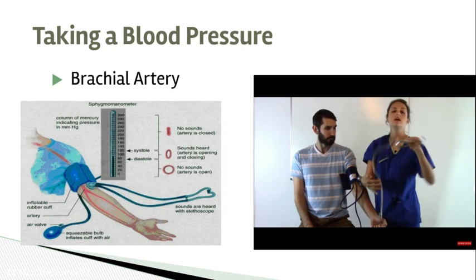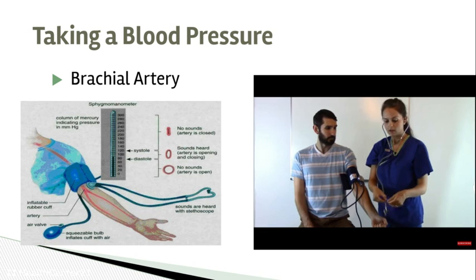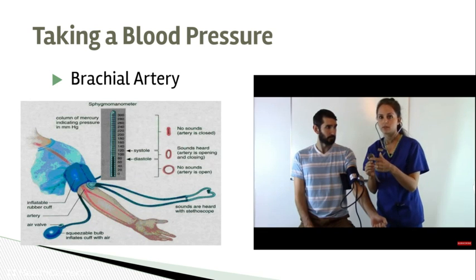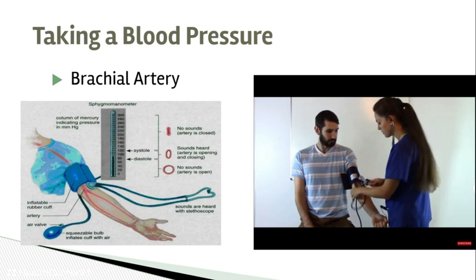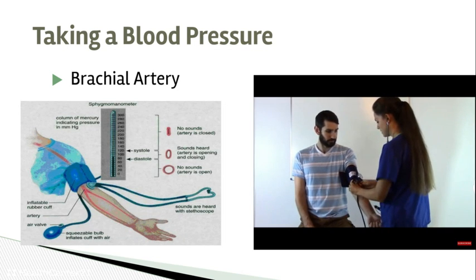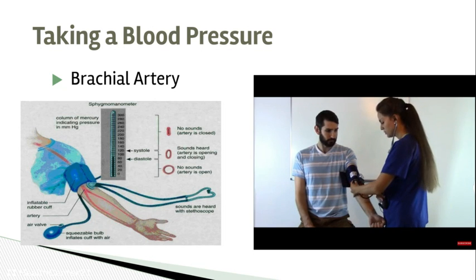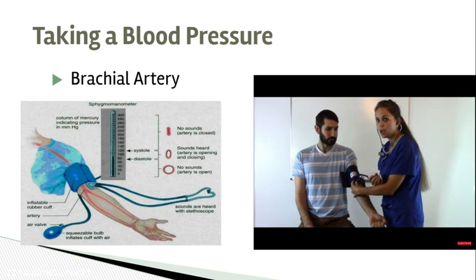Now what I'm going to do with my stethoscope is I'm just going to listen at that artery. A lot of people, it really doesn't matter. You can listen with the diaphragm or the bell of your stethoscope. Studies have shown it does not matter. I like to use my diaphragm. So I'm going to place it over his brachial artery. Let me feel it again. Feel it right there. And now I'm going to close the valve on the blood pressure cuff, and I'm going to pump it up.